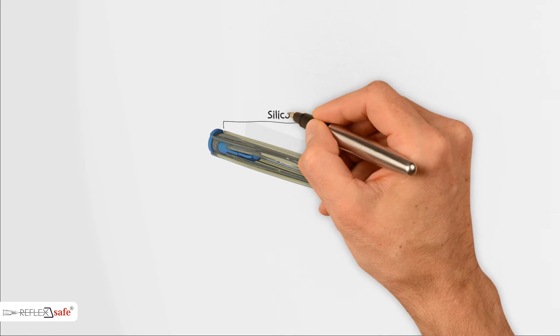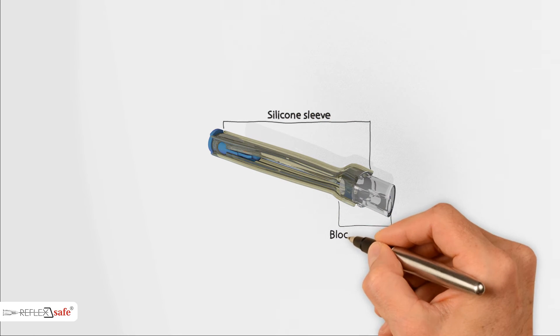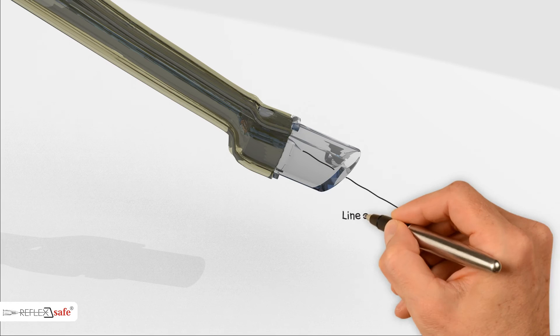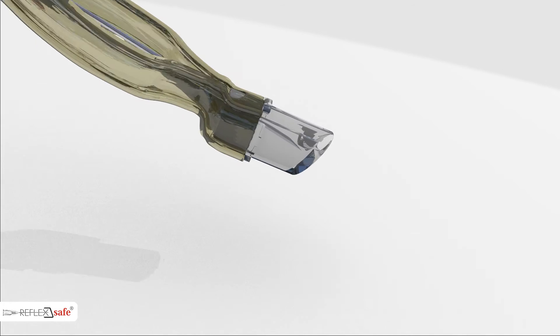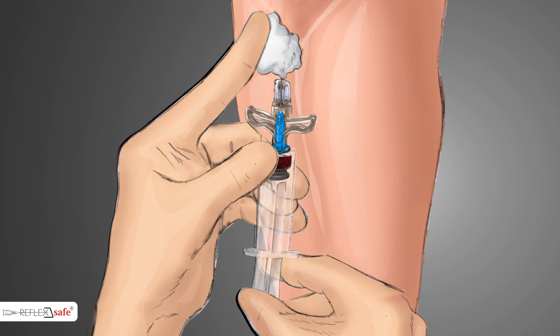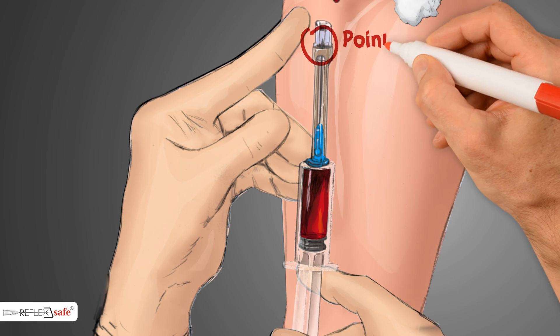The Reflex Safe Needle has a silicon sleeve that covers the needle, and a thick base that acts as a blocking chamber for the point. Close inspection shows that the outwardly flared passageway is located off-center, thus preventing the needle from exiting the safety sleeve without deliberate action. During a procedure, the blocking chamber sits against the skin of the patient. If the needle were to be suddenly withdrawn, whether voluntarily or not, the sleeve automatically extends, covering the exposed tip.